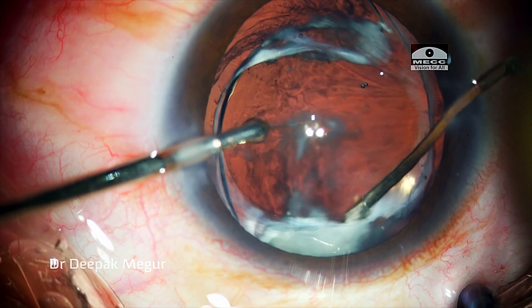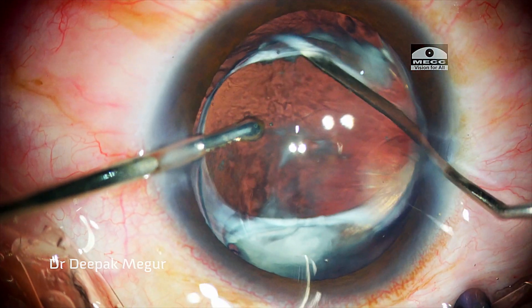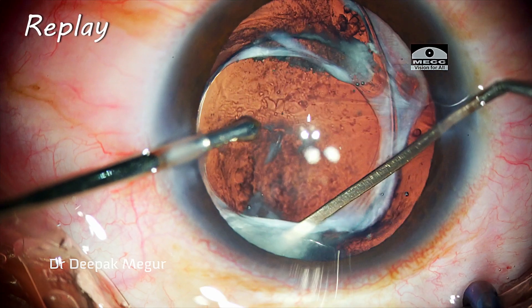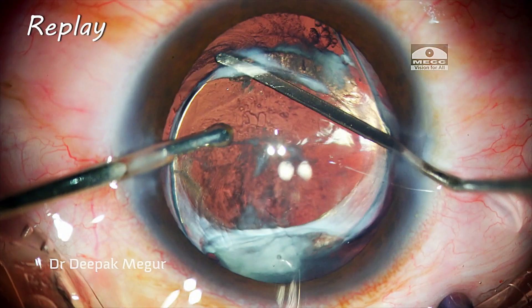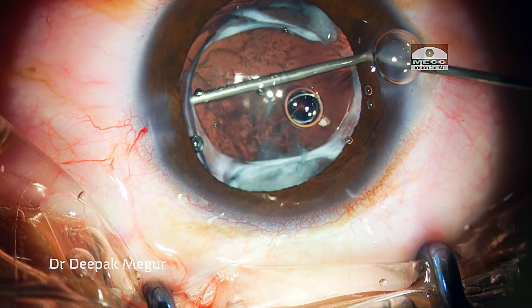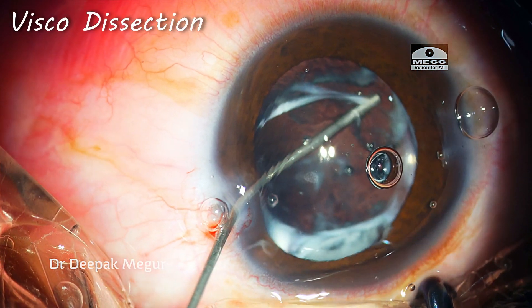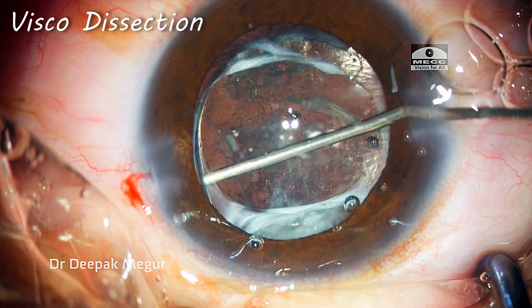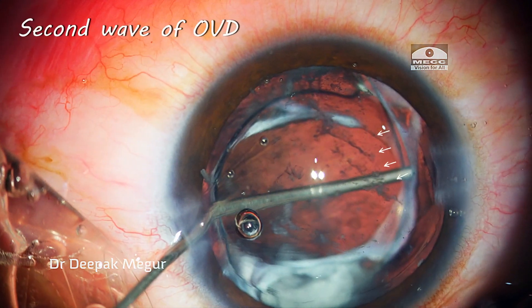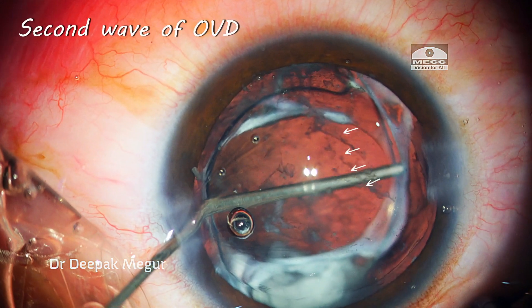I'm using a flat iris spatula to negotiate between the capsule and the lens. While performing blunt dissection, I need to be careful to avoid any undue stress on the zonules. We must be aware that we can induce zonular dehiscence during these manipulations. I could get access to the underside of the anterior capsule and the adhesion between the capsule and the lens could be separated. Now I'm injecting OVD under the rhexis margin, and I can see that the OVD flows behind the IOL, confirming that the adhesion between the rhexis margin and the PMMA lens is cleared.